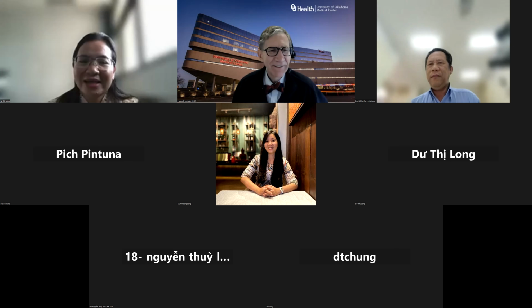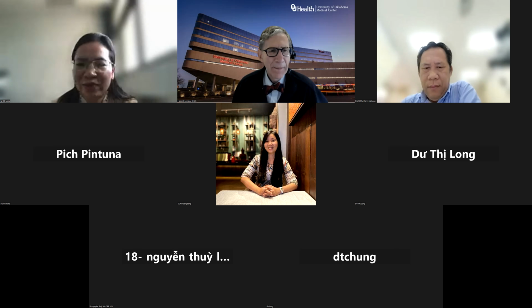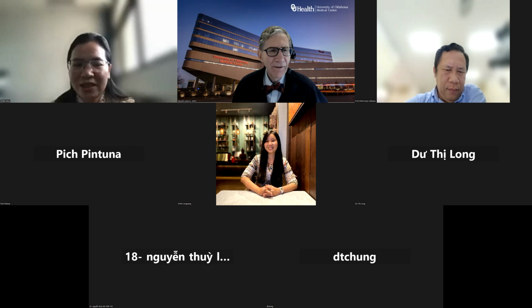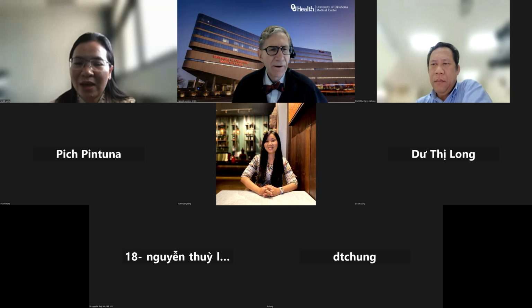Yes, please. I had a question about myofibroblastoma of the breast, and how can we differentiate, on core biopsy, between myofibroblastoma of the breast and something like carcinoma with spindle cells, when we have only the periphery of the core and we see maybe a carcinoma, we are not sure.